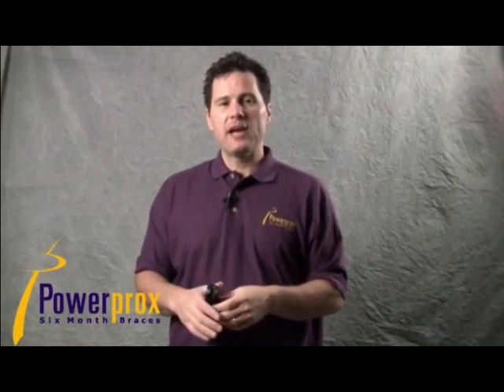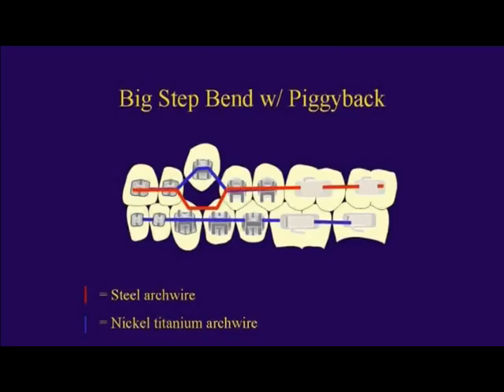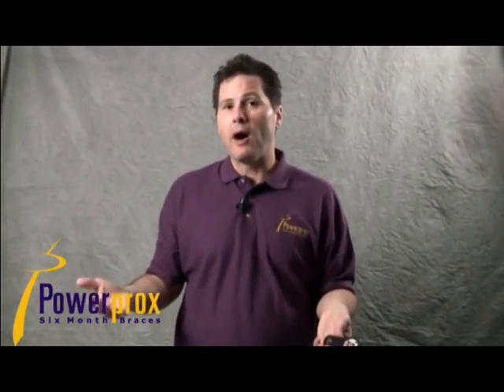Now, if you have a situation where, once the canine's coming down, the canine itself is going to hit the main wire, what you can do is place what I call a big step bend wire with the piggyback. In the main arch wire, you place a little step down bend to give a little extra window for that canine to come down into, so the cusp tip will not hit that main arch wire. Now, in order to make that step bend, you have to be in a steel arch wire. So an 018 steel is perfect for that. And again, your nickel titanium, even just an 014, works very well.